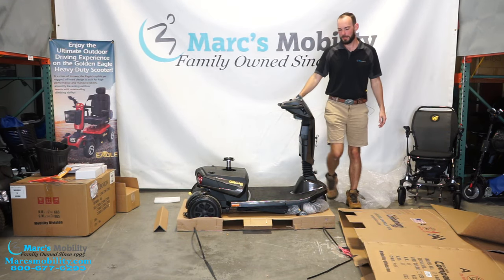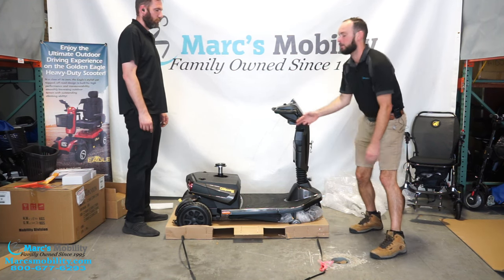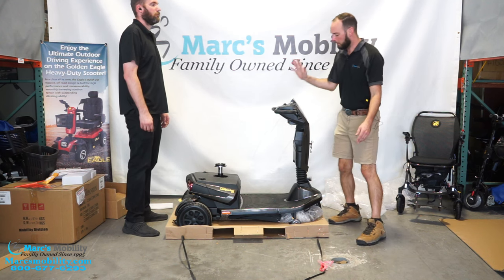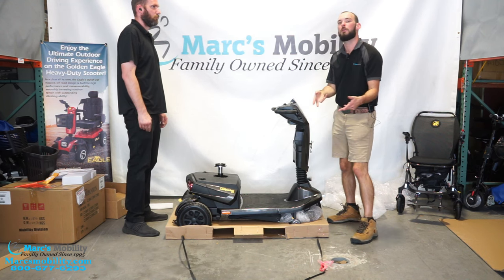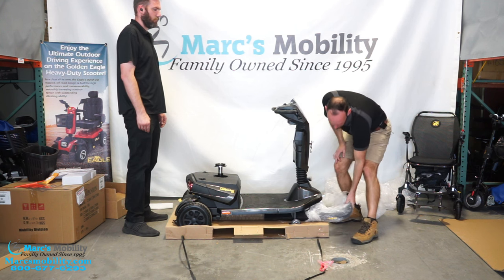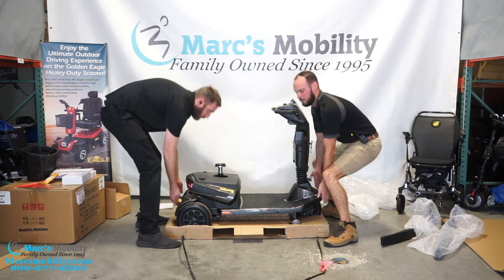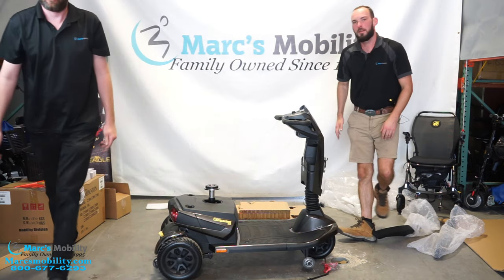Now we have our scooter unboxed. You might be able to lift it out by yourself by moving the front and then the rear, but this is a heavy scooter — I do not recommend that. I would recommend grabbing a second person, lifting the scooter up, and setting it to the side. Keep in mind on the HD, your scooter arms are underneath, so try to lift up over the arms or you can try to pull them out beforehand. You might be able to slide these out, then just pick the scooter up and move it forward.